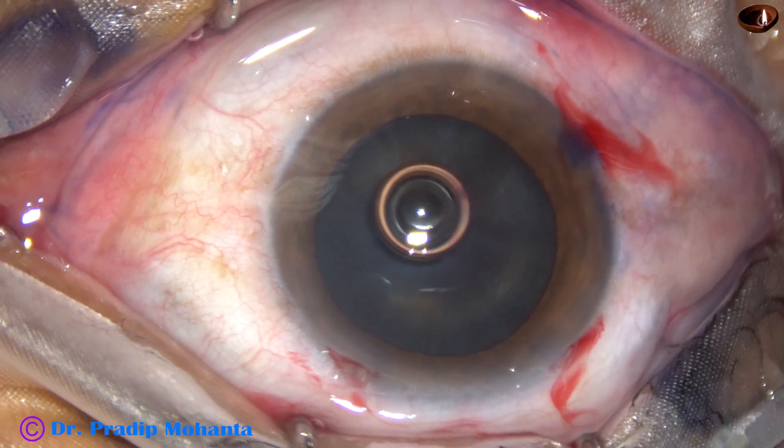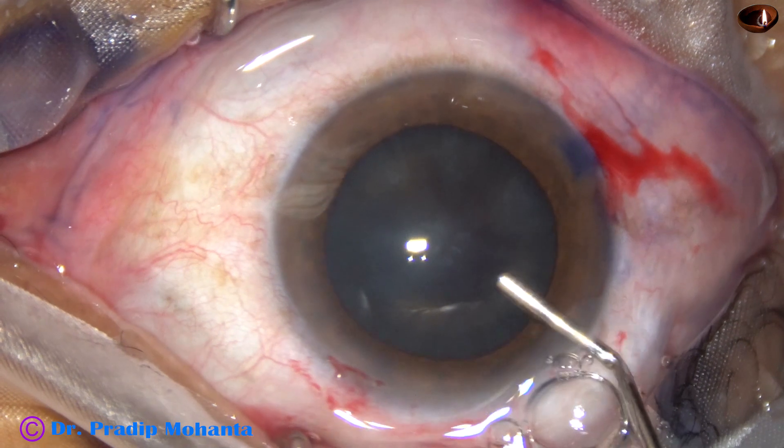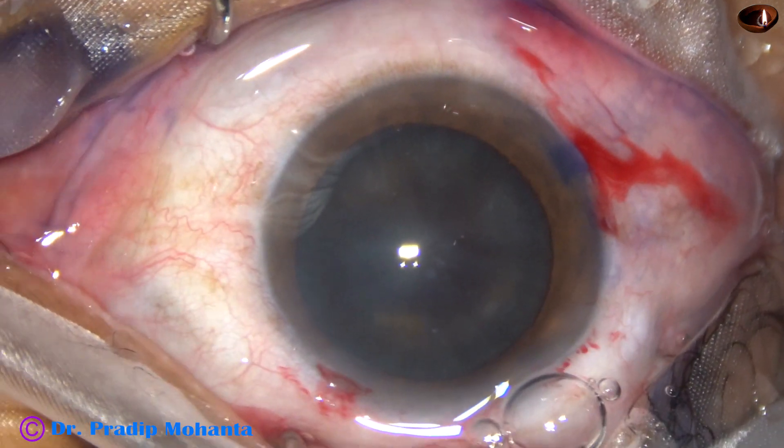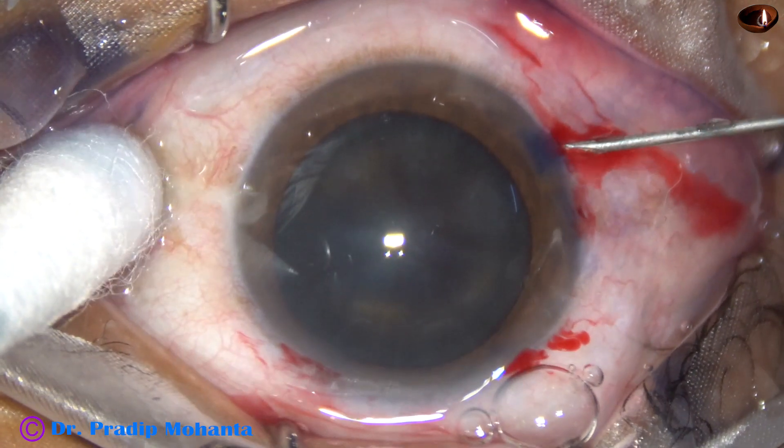2% hydroxypropylmethylcellulose is injected into the anterior chamber. And at this time, we see that the pupil is very nicely dilated.